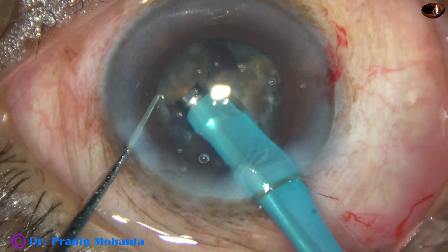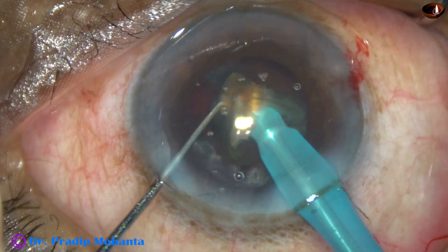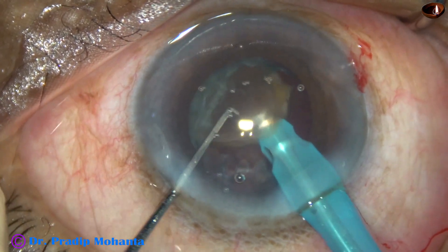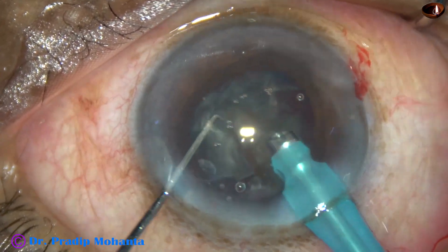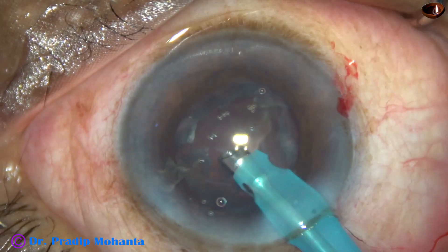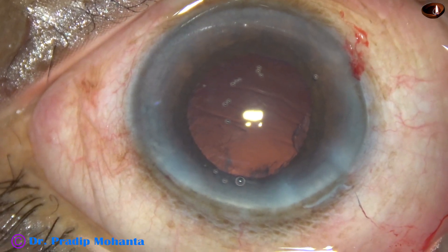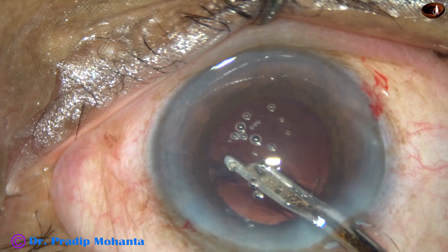This may be because of the unique shape of this easy tip — the end of the phaco needle is wider, the shaft is narrower, and around the shaft there is a lot of fluid which keeps the wound cool. This is the last but one hemi-nucleus, and this is the last big chunk of nuclear fragment. This nuclear fragment is divided into two pieces and emulsified, and the epinucleus is held and also emulsified. So this is submarine chop.